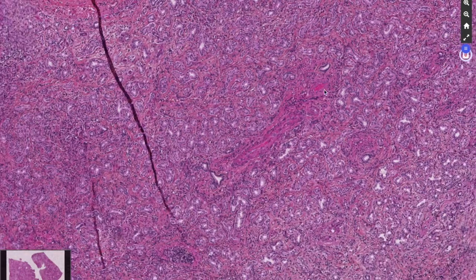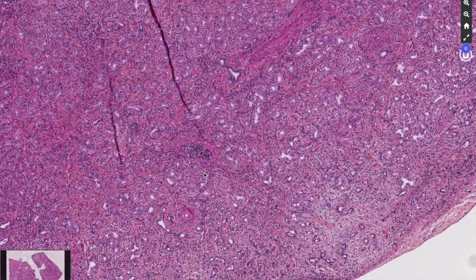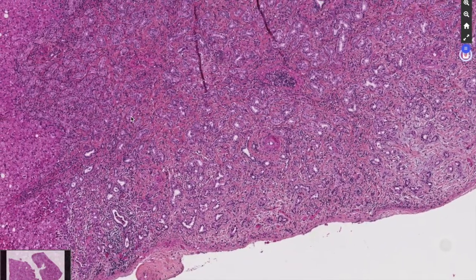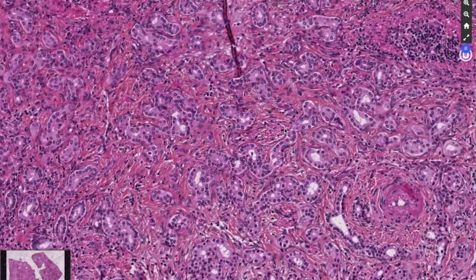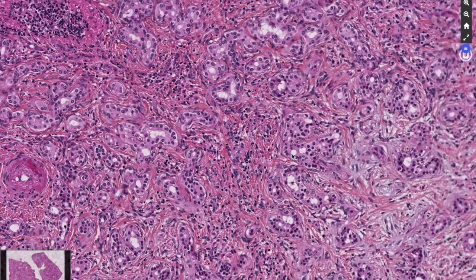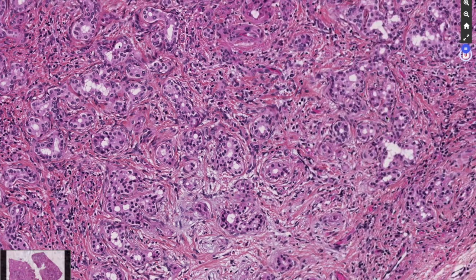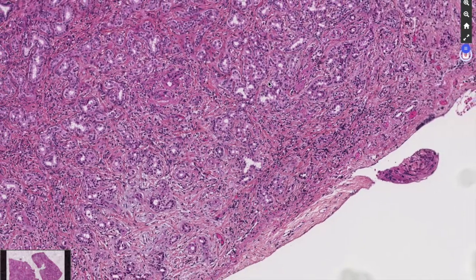And it's important because these lesions often develop in the vicinity of a portal tract, and you can usually identify the portal tract at the center of these lesions. So the appearance is everywhere quite the same. You have here also inflammatory infiltrates, all these ducts, no or only very little atypia, some edema. And the diagnosis in this case is pretty straightforward. It's a bile duct adenoma.